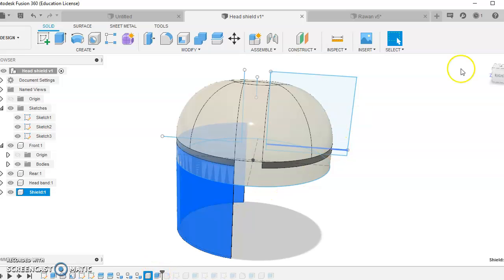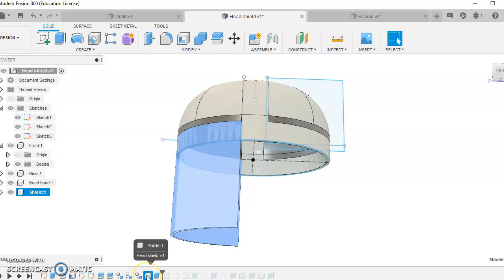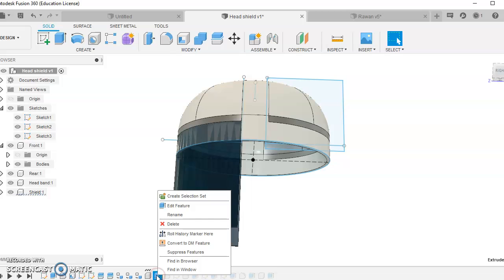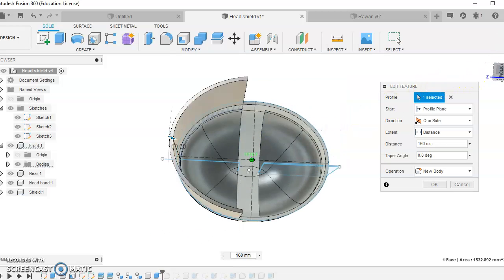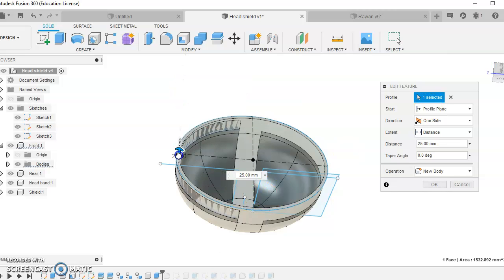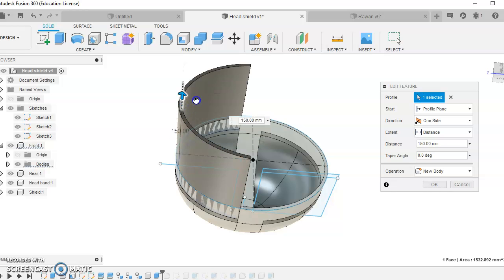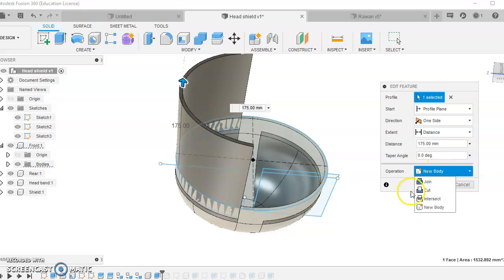Now here you can see how I've built the face shield. If I go into edit feature, what I've done there is grab the inside surface of that shield, just here, and extruded that to a distance of, I think it was 175. And I've called that a new body, so I'm quite happy with that.